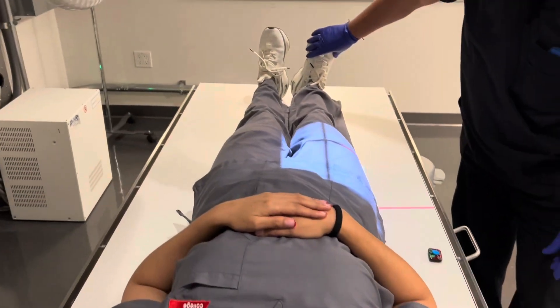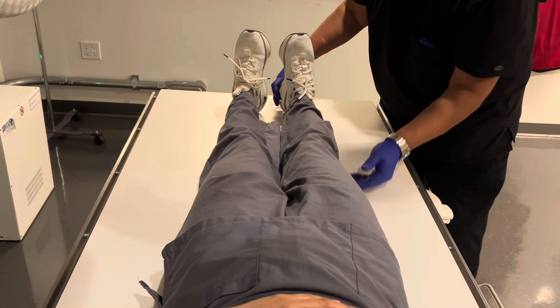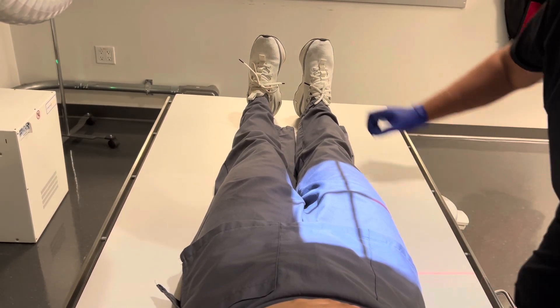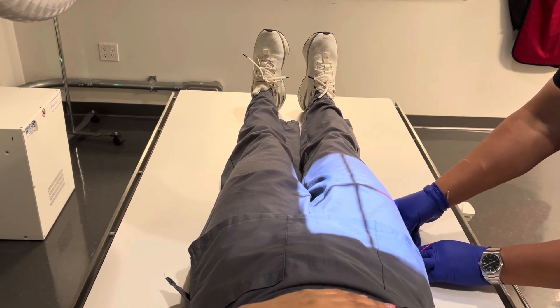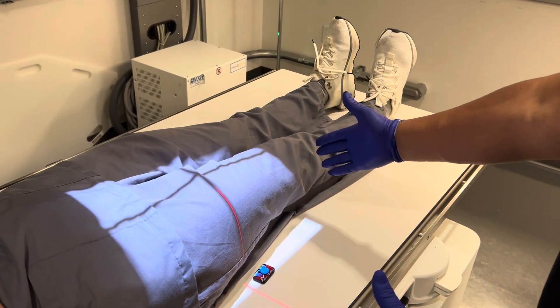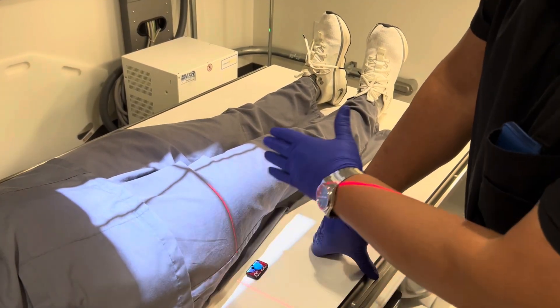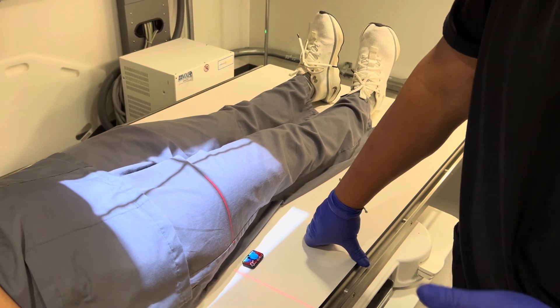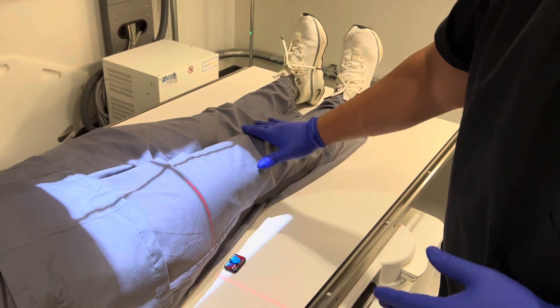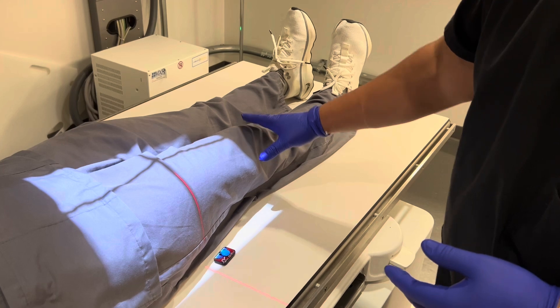Her leg is already straight. If her foot is rotated down, it's going to rotate the femur, so we have to turn the leg straight — if the patient can, of course. If it's trauma, you're not going to do this. You could put a sandbag against her foot to help hold it. I put the marker on top of the table — I want to make sure I incorporate the anatomy and I'm not cutting off anything. The technique for the proximal femur is about 16 to 20 mAs at about 70 to 74 kV. She's on the petite side, so she'd get about 16 mAs at about 70 kV.